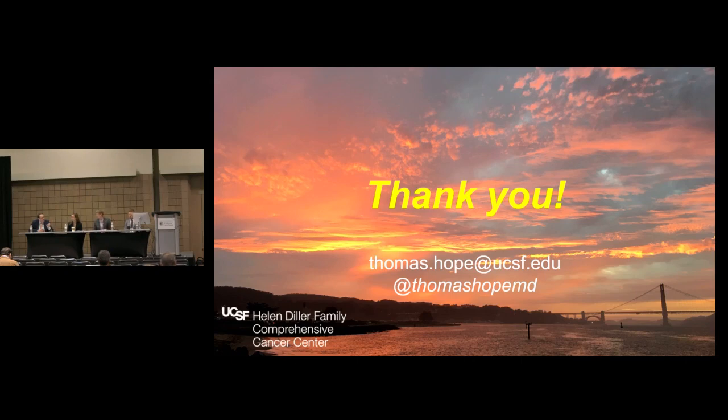Tom, for those who don't have access to a PET MRI scanner, do you find that cross-modality fusion is accurate enough to allow you to fuse it up to an MR? Yeah, absolutely. You could get a DCE MR with contrast, and it works just fine. Actually works great. And you don't even need to fuse them; we cognitively fuse them, without actually trying to overlap them, and it works just fine.